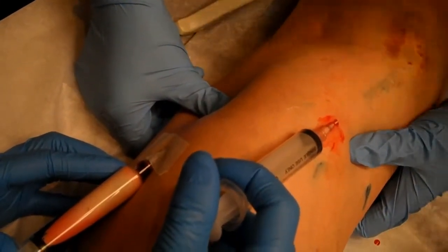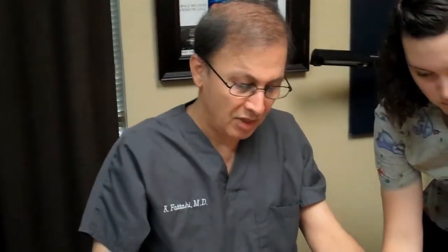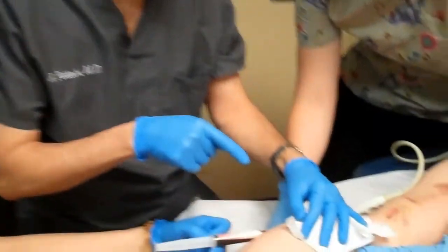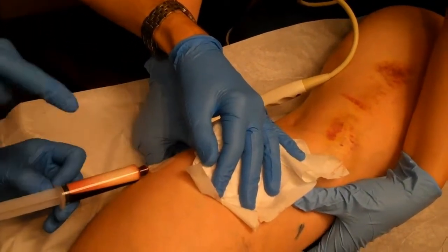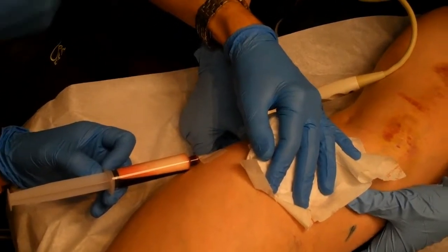We are doing a very selective, segmental treatment and the foam has no chance to go anywhere else this way. This method is applicable to many different situations when dealing with varicose veins. The reason we don't see any visual disturbance is most likely that this syringe contains endothelins — those are vasoactive substances created from endothelial damage — and they are going to be dumped in the trash.